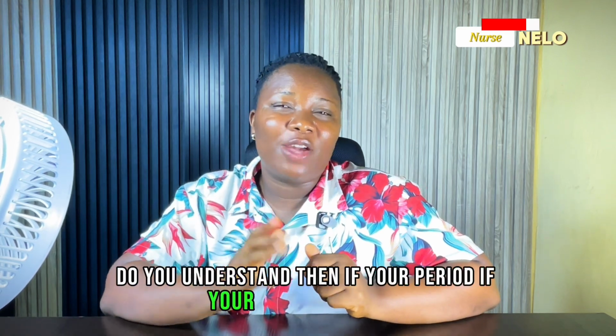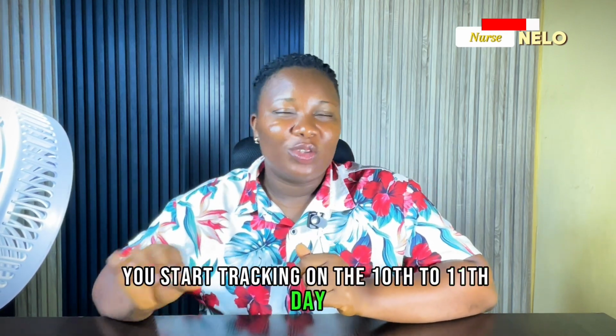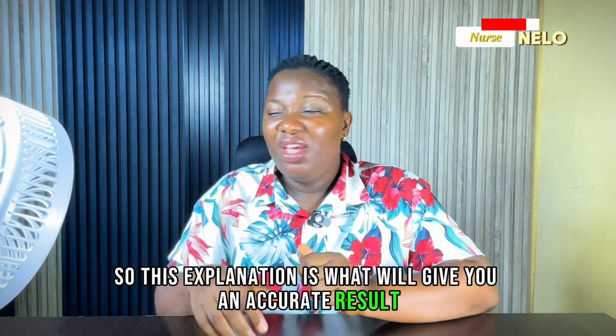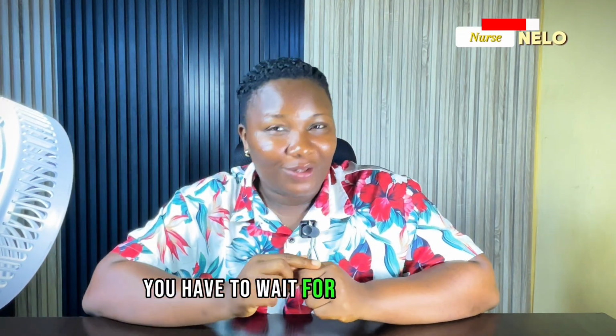Then if your cycle is 30 days, you start tracking on the 10th to 11th day. So this explanation is what will give you an accurate result. If you don't know your cycle, you will miss the day of tracking and then that cycle will pass. You have to wait for another cycle.